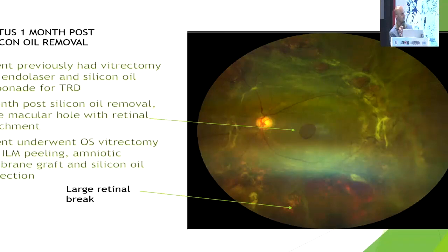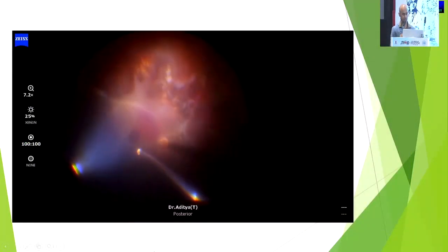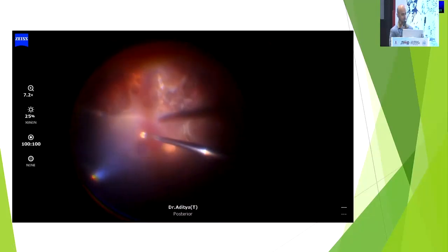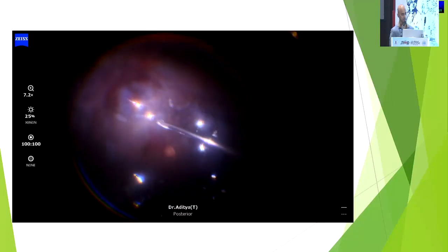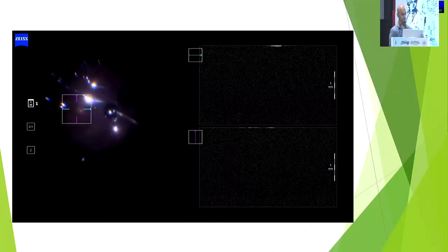He has two large holes, many large holes, including one in the center of the retina. So the task was to manage this patient who also has a macular detachment, obviously because there is fluid now on the posterior pole. So the idea was to plug this macular hole and peel off the membranes, and therefore we had to use something different because there's no retina left. Autologous retinal graft is not possible here. So we went ahead and operated on this patient, clearing up the vitreous hemorrhage. After the fluid-air exchange, I drained the subretinal fluid from the peripheral break and stained the membranes with Reti Blue dye.